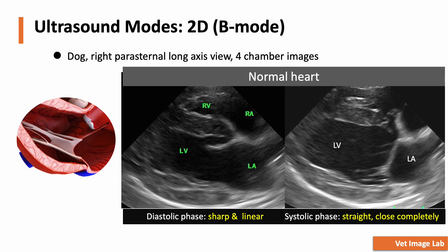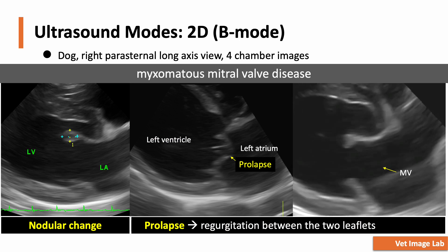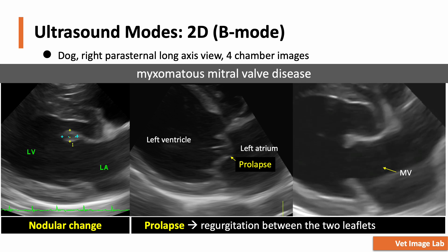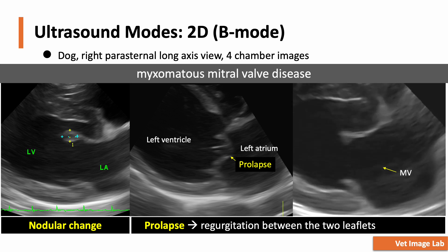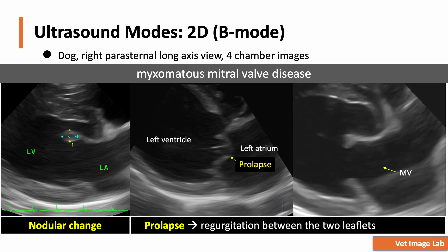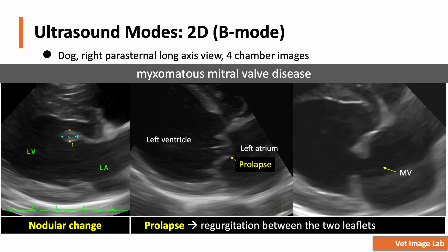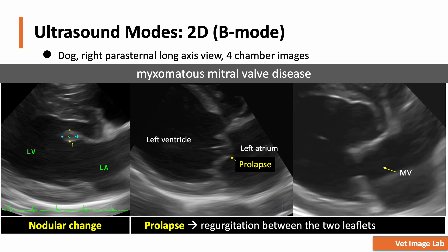On B-mode, we can clearly assess the mitral valve's shape and movement throughout the cardiac cycle. During diastole, the mitral valve opens with a sharp, linear shape, allowing blood to flow from the left atrium to the left ventricle. During systole, the mitral valve should close straight and completely, preventing any backflow into the atrium. But in this dog with myxomatous mitral valve disease (MMVD), you can see a distinct abnormality: the tip of the anterior mitral leaflet is noticeably thickened, and during systole, instead of closing properly, the valve prolapses into the left atrium, leading to mitral regurgitation.